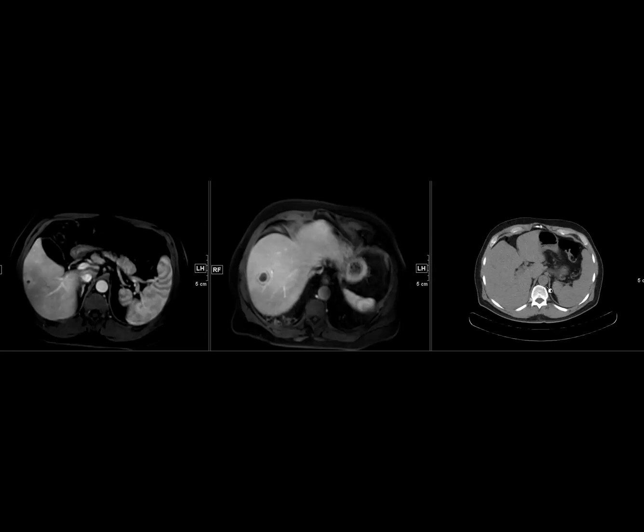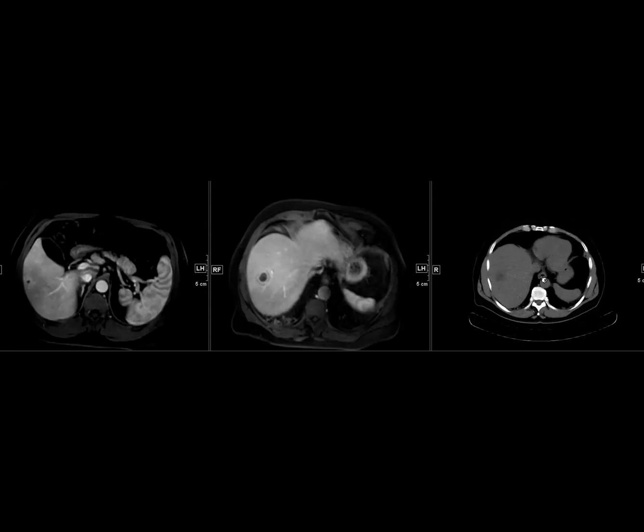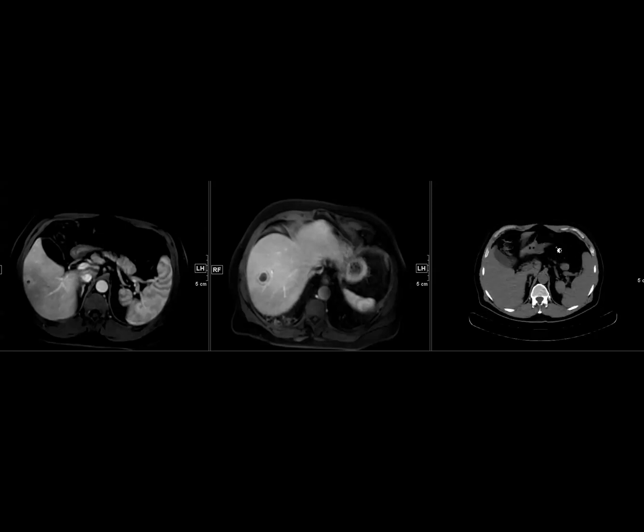So the time difference between the MR and the PET is, let me calculate, 2 months. Can't really see it on contrast, but you can see that it hasn't really changed. So I guess that's not very helpful. And were they treating with antibiotics in between? I'm trying to see the results. No. They were not treating. The patient didn't get worse, but they also didn't get better.